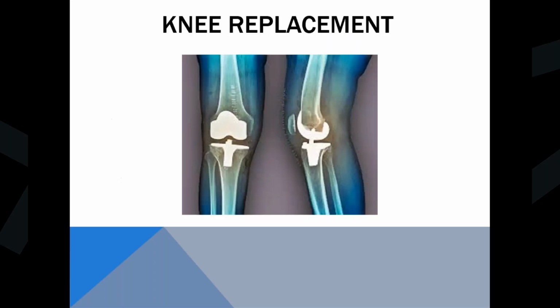And then here's an image you might see for a knee replacement. So they would take a lateral and an AP shot of the knee, and then make sure the knee moves its full range of movement, and that there's nothing obstructing or holding up the movement.